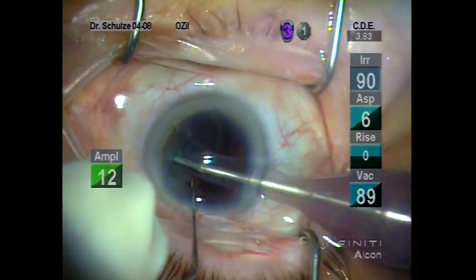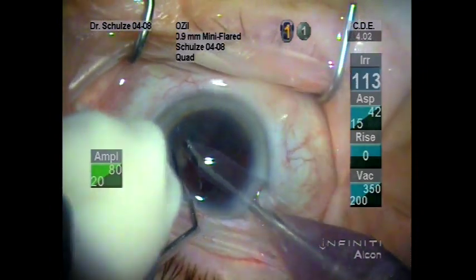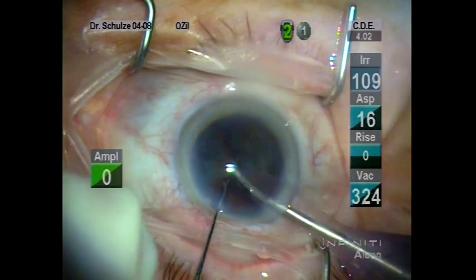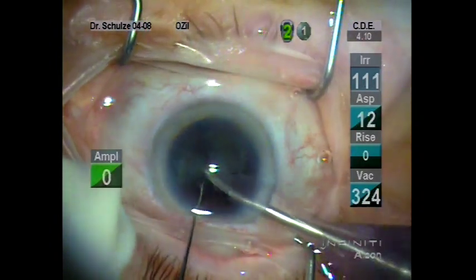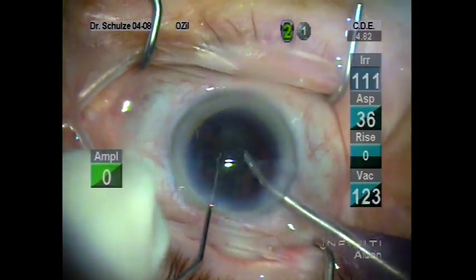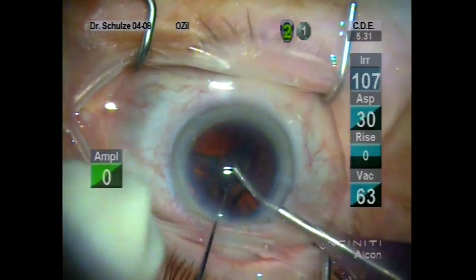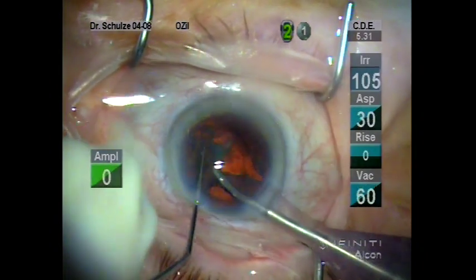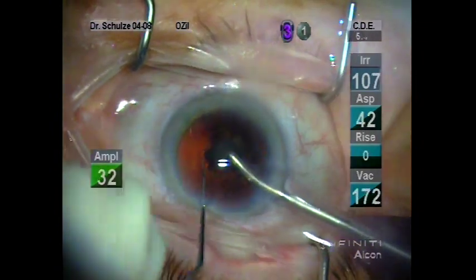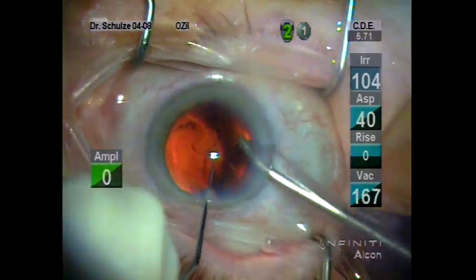We're moving on here towards the second hemisphere, again creating a very small notch, which we engage with the Becker nucleus rotator and the FACO tip, converting that hemisphere into a quadrant, elevating the apex, and engaging with the FACO tip in the safe zone towards the central area of the iris. I prefer to elevate slightly away from the posterior capsule to minimize my risk of tearing the capsule. When it's time for the final quadrant, I'll place the nucleus rotator beneath the nuclear segment and the FACO tip to try to prevent the posterior capsule from coming forward into the tip.